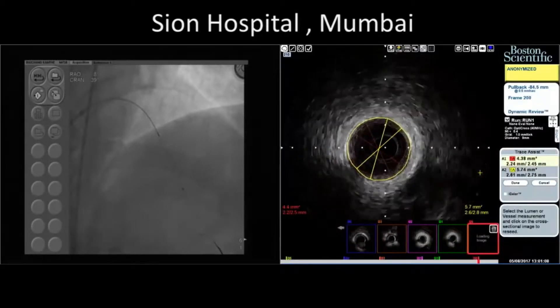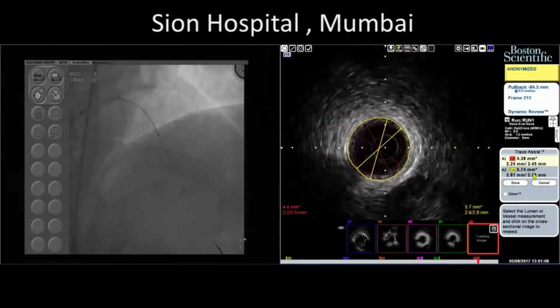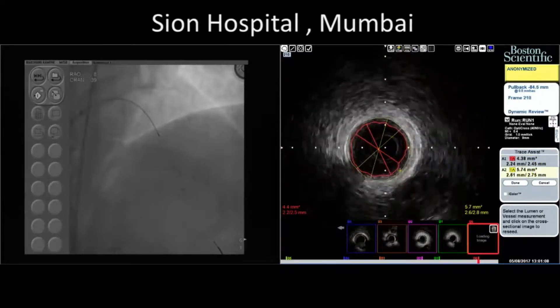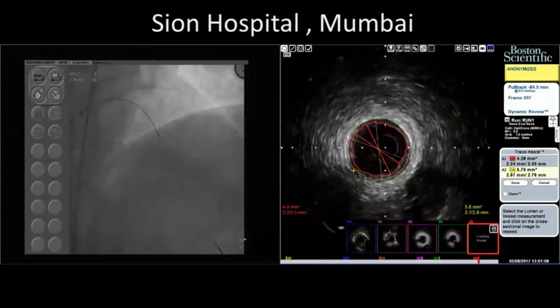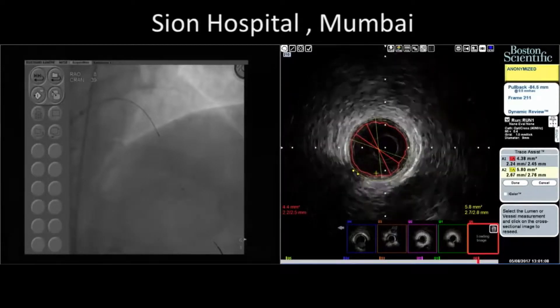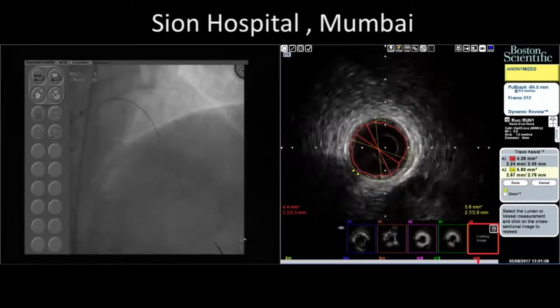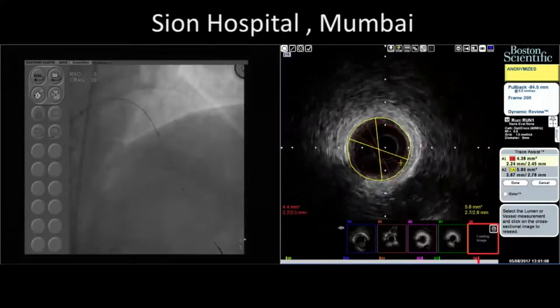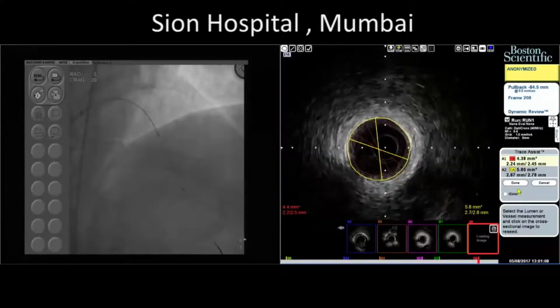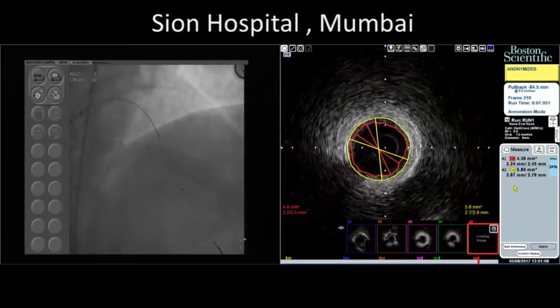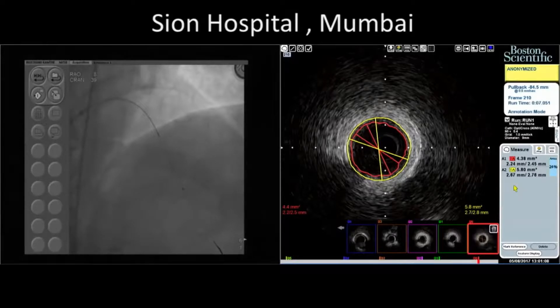Put a 2.75. And the proximal portion we will dilate with a 3.5 maybe — Miras 2.75x29. So we have Miras 2.75x29.